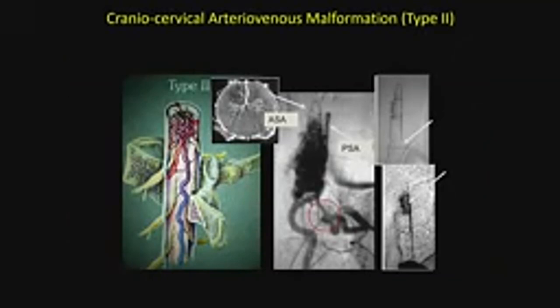This is a true spinal cord AVM. Some of you know that as type 2. Now, like in the brain itself, you can have a supply from the anterior spinal artery through the sulcocommissural artery, you heard it before, or you can have it through the superficial anastomosis through the posterior spinal artery, like in this case, as well as through the perforators from both posterior spinal arteries. Why is that so important? If you have a situation where there is a posterior and anterior supply to the AVM, you have to start thinking, what is the goal of your embolization? Can you cure the AVM, or do you end up closing from the anterior circulation, so the anterior spinal artery access, and then leave the surgeon the posterior? It's not always an easy decision. So that is something that really needs to be discussed upfront.